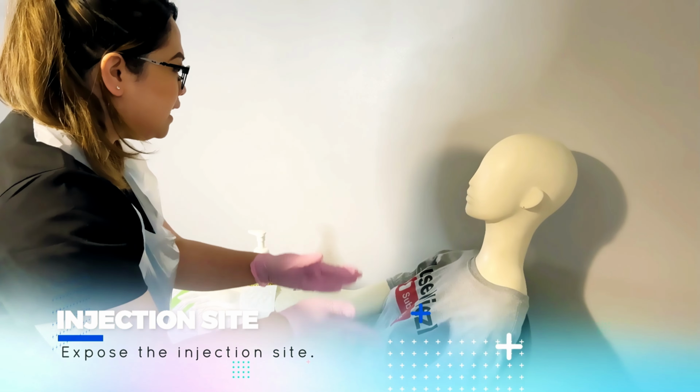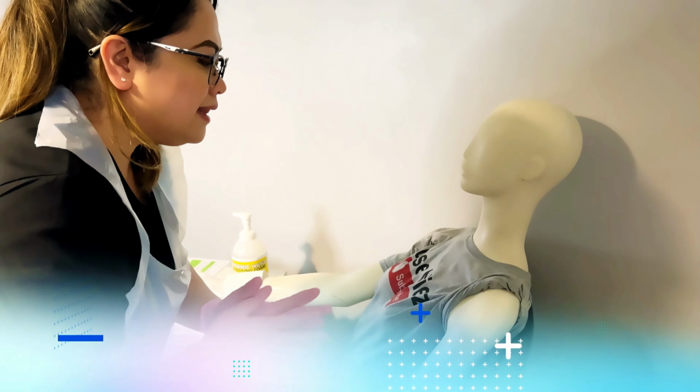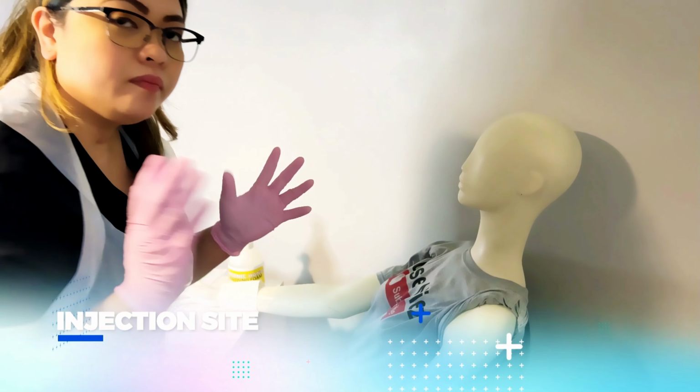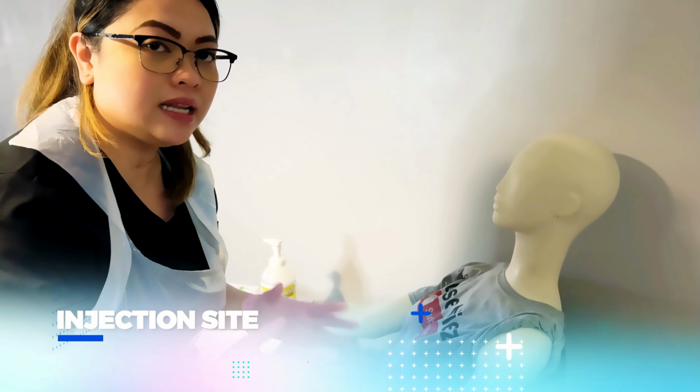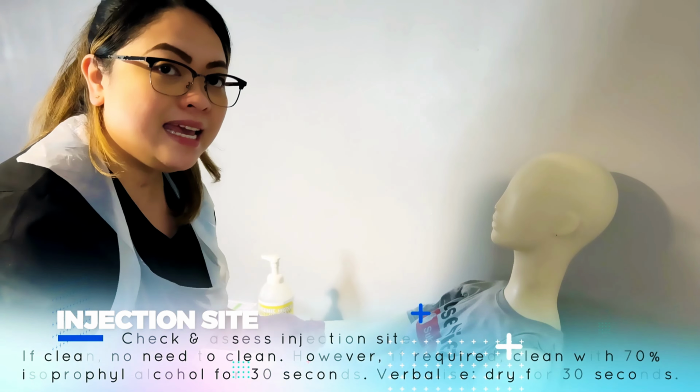Alright, I can see that the injection site is clean. There's no signs of inflammation, rashes, edema, infection, or any skin lesions, okay? So I can see that the injection site is visibly clean. Basically, if the injection site is clean, no need to clean it unless otherwise cleaning is required.